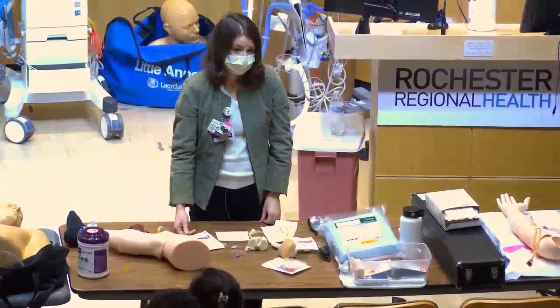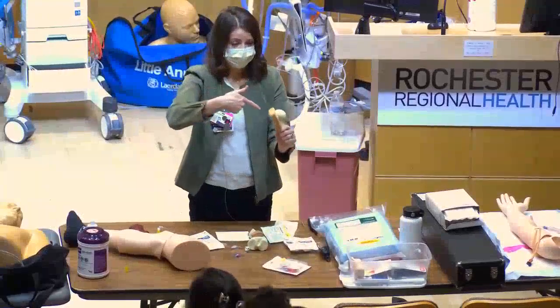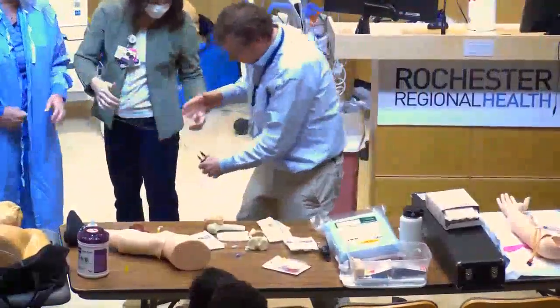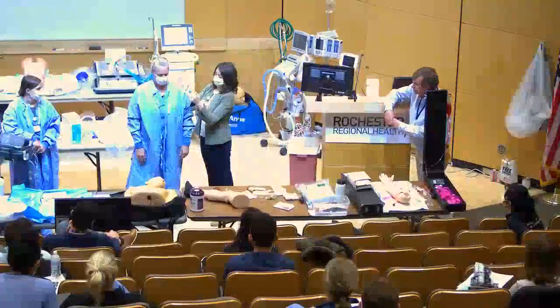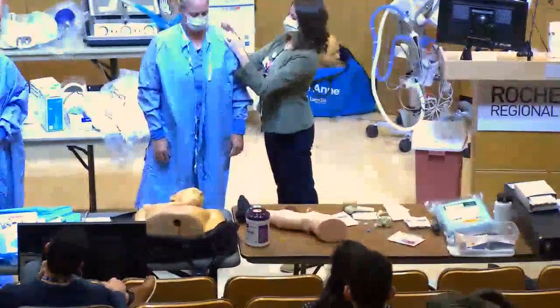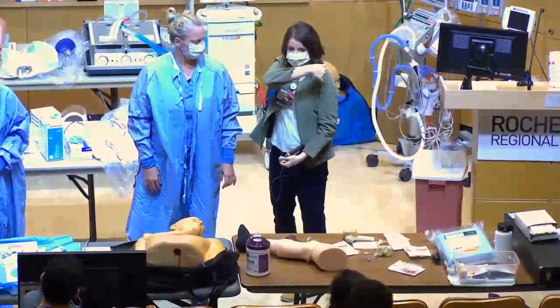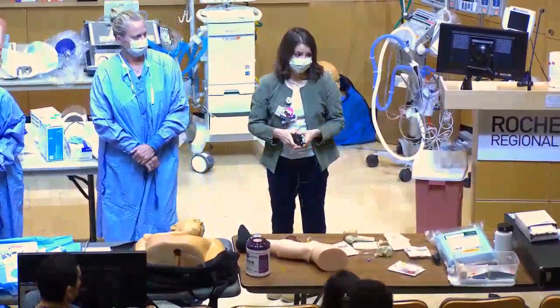If a patient is awake enough to need lidocaine, you probably have time for a central line. The only difference for a humeral IO is that you go in at a 45-degree angle instead of 90 degrees. Locate the humeral head by placing your hands around the shoulder — it feels like a giant golf ball — then go down at 45 degrees from there. The flushing technique is the same.